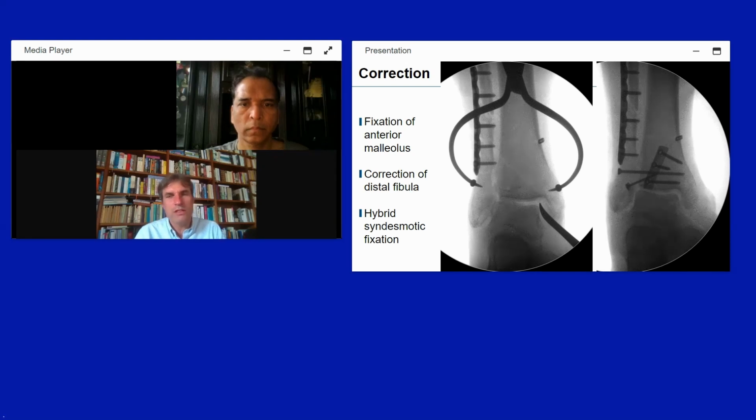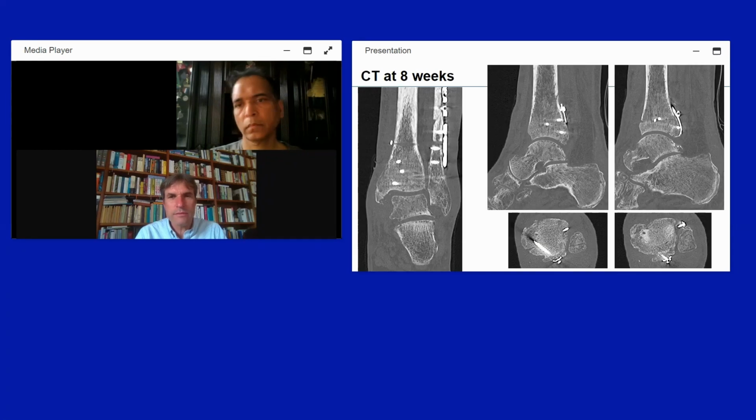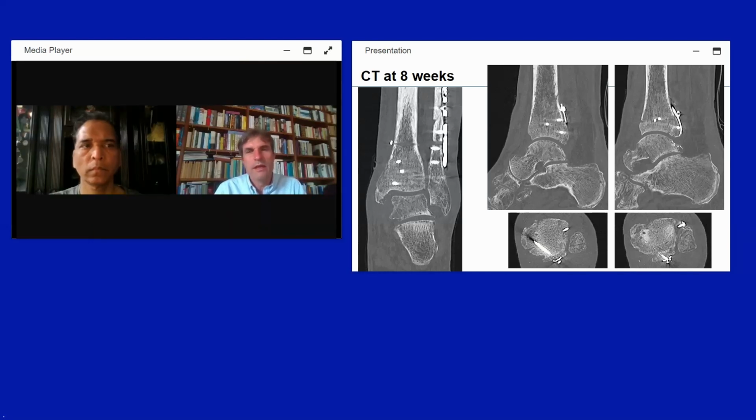Of course, you can also put the patient in a somehow floppy lateral position if you really need to go there. We tried to push it a little bit, and then we thought we were with a stable ankle mortise. And in this patient, I felt it would be better to also do a temporary fixation of the syndesmosis. So we did in this, because it was an old case, we did a hybrid fixation. So when the screw breaks after the patient takes up walking again, then he still has that flexible implant further up that still holds everything together.